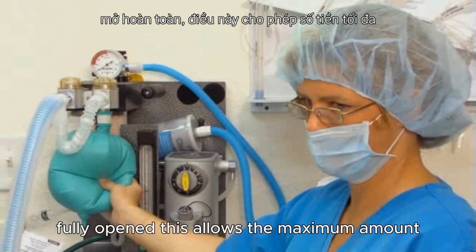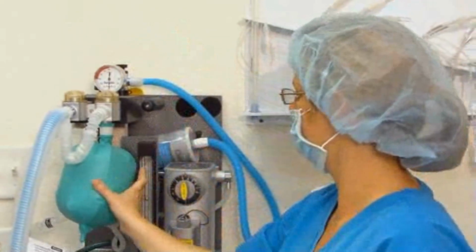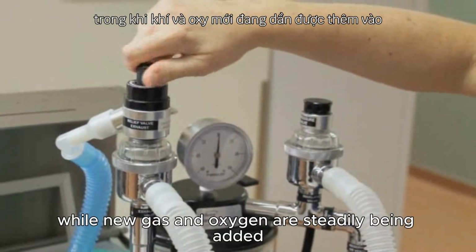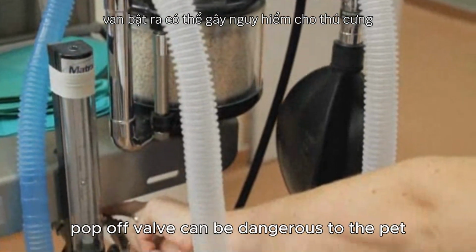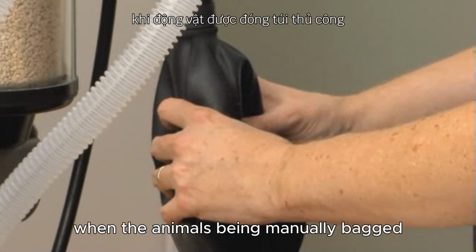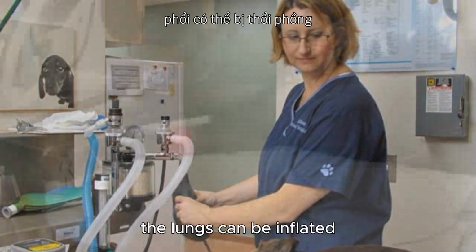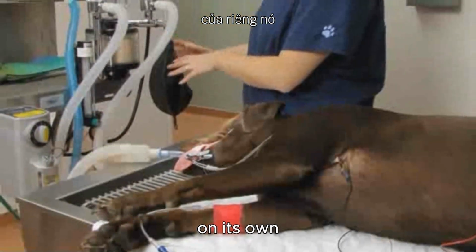Fully opened, this allows the maximum amount of gas to escape into the scavenger system. Fully closed, no gas leaves the system, while new gas and oxygen are steadily being added. A fully closed pop-off valve can be dangerous to the pet and should not be fully closed except for very brief periods when the animal is being manually bagged or mechanically ventilated. By compressing the bag with the pop-off valve closed, the lungs can be inflated. This is sometimes beneficial when an animal is not breathing regularly on its own.